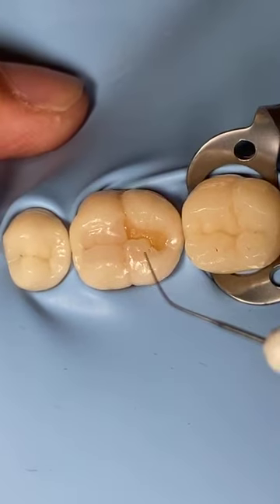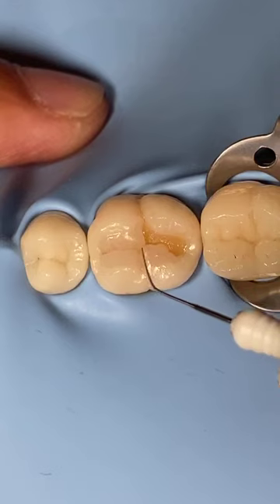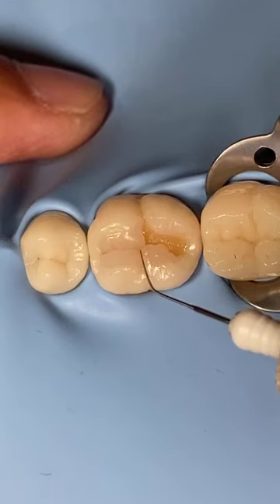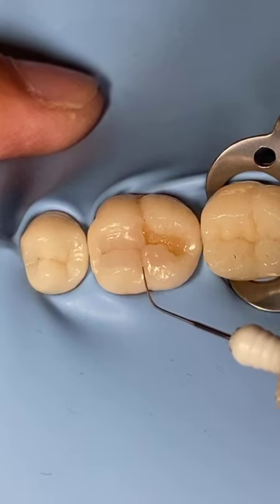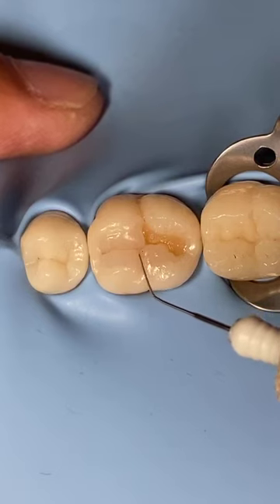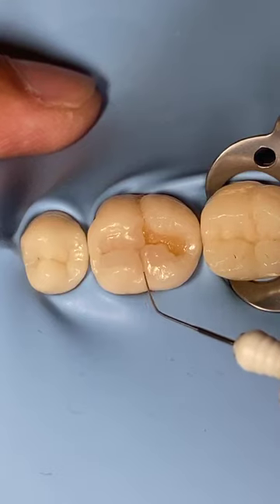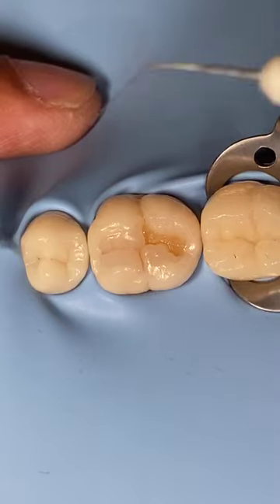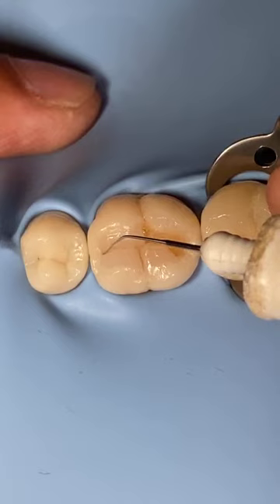It's easier for you to create separation now. Remember the dot technique. See, it's very easy because you already create a separation when you are doing that stabbing technique.